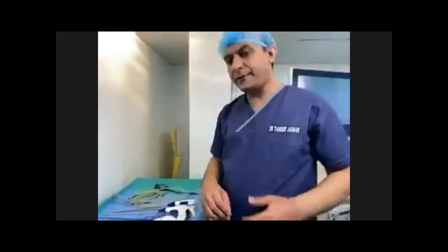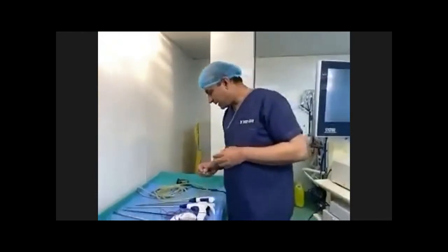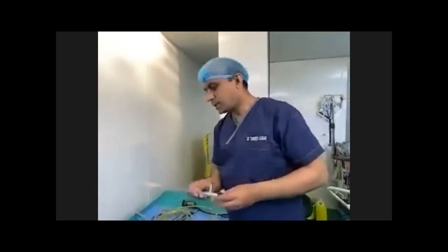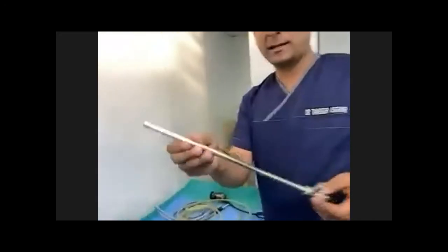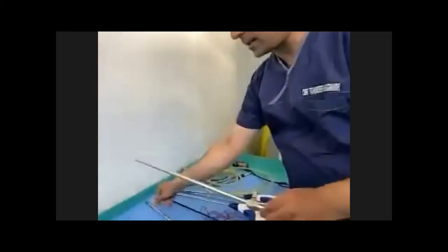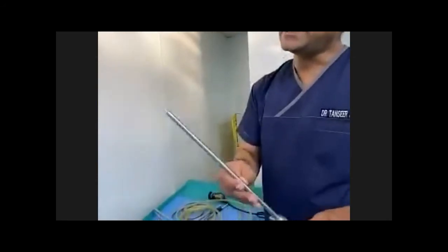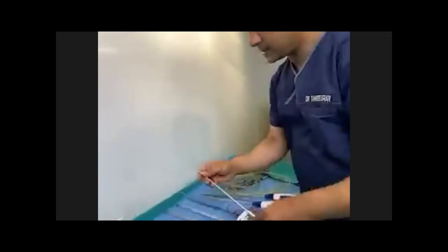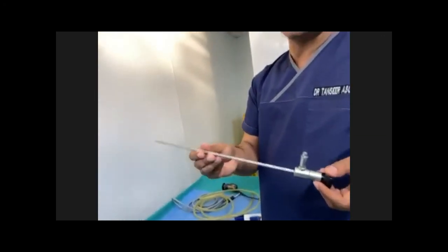So this is a brief description of some of the important instruments we are using in laparoscopy. Then there are a few things which I want to tell you. This is a telescope, which is a 0-degree telescope and 10 mm in diameter. I will tell you in more detail when I tell you about the lap stack. This is a 30-degree telescope, 10 millimeters. And this is a 5 mm telescope with 0-degree.